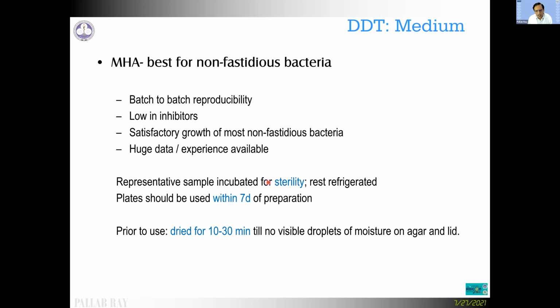Now, the medium that we will be using, the Mueller Hinton agar plates, should be tested for sterility and should be used within 7 days of preparation. And they should be dried for about 10 to 30 minutes, until no visible droplets of moisture are there on the agar and lid just prior to inoculation.